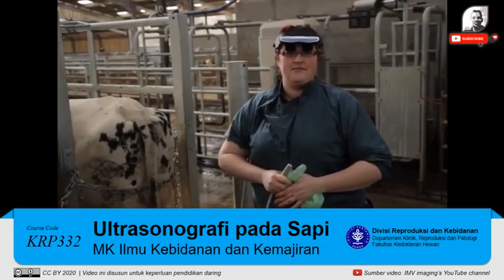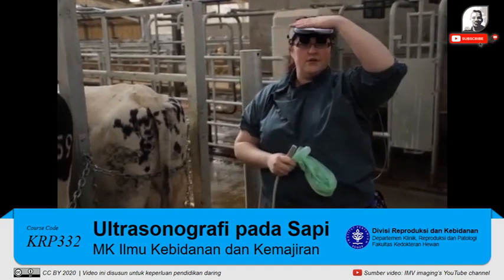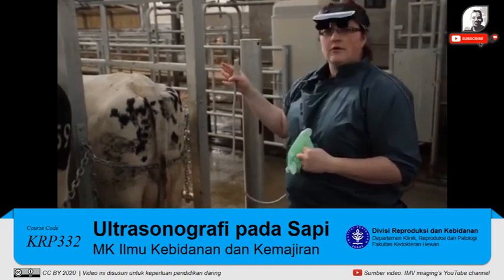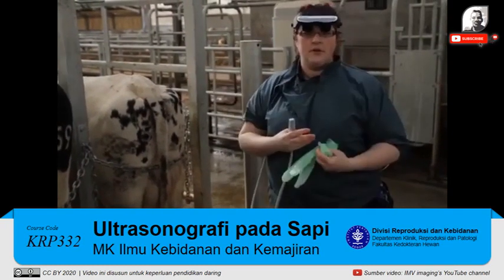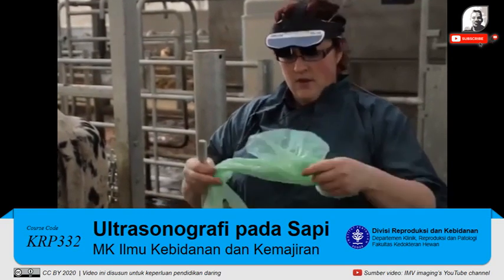Now we're ready to get scanning. We have our console, our viewing device, and our probe. Our cows are set up, it's a nice safe environment, everything's nice and calm, and we're ready to go.